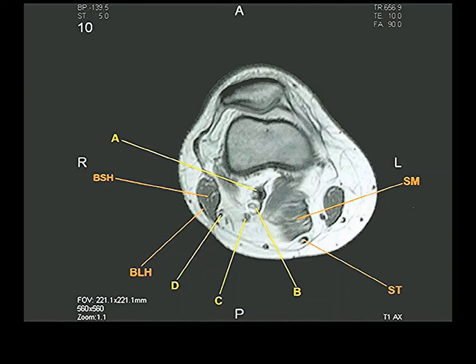The popliteal artery is the deepest of these three structures — right against the bone, which makes it very hard to palpate a popliteal pulse. Then comes the popliteal vein, and then the tibial nerve. The common peroneal nerve sits deep to the biceps tendon. Then gastrocnemius comes in.